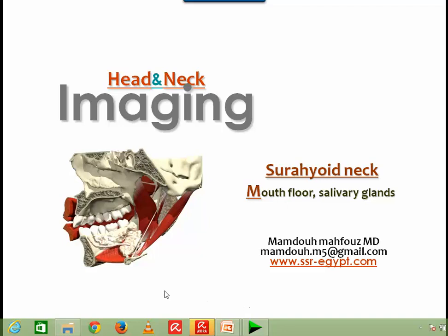Dear colleagues, now we are going to discuss an important issue, which is the imaging of the neck proper. And you know that the neck is generally divided from the imaging point of view into the suprahyoid neck, the structures above the level of the hyoid bone, and the infrahyoid neck.